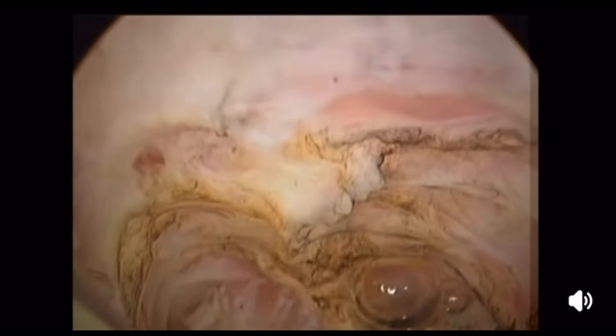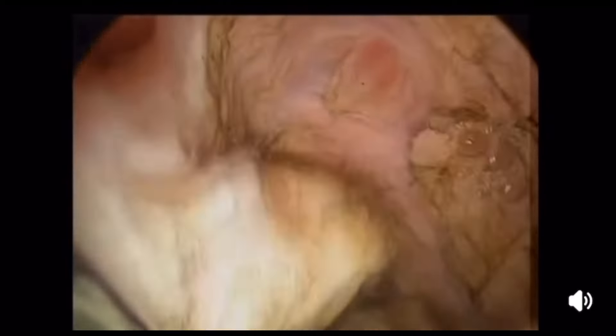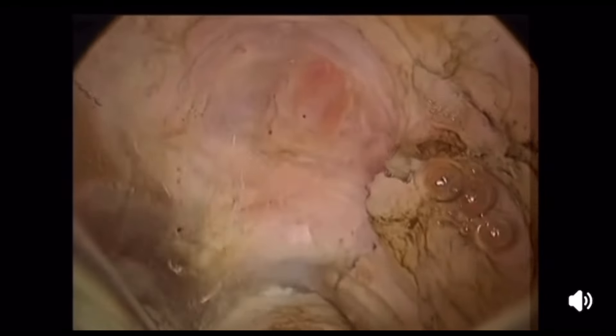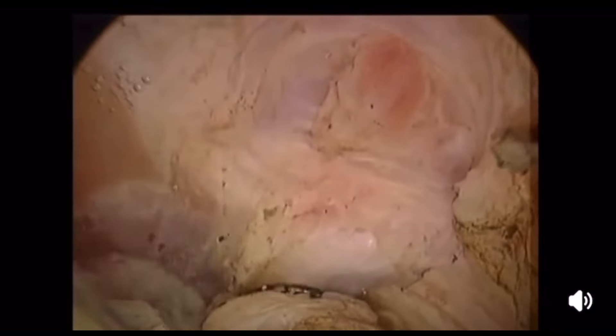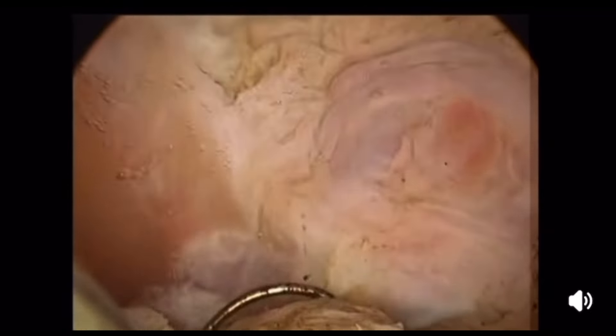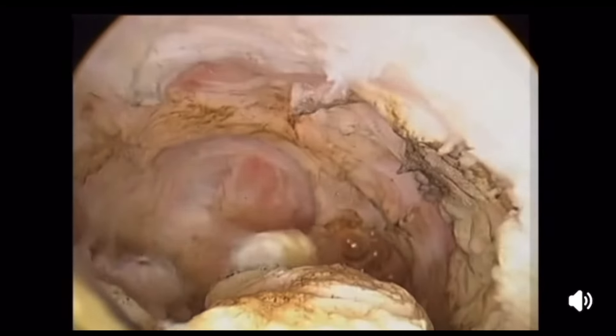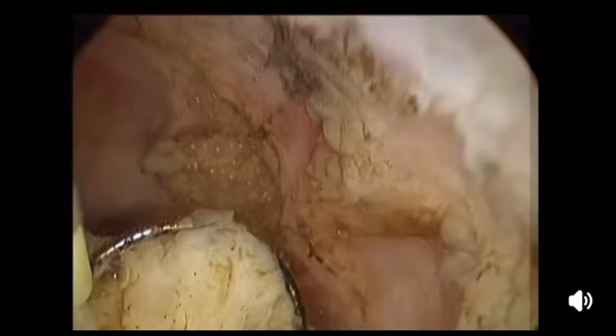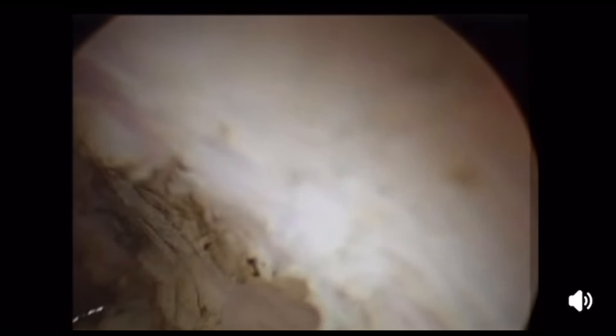Almost the myoma is resected — you can identify the myometrium, which has a distinct pinkish color. The backhand movement was very nice to remove the final part of the fibroid. The backhand movement should be controlled: push forward and down, forward and down — this will detach the last part of the myoma.